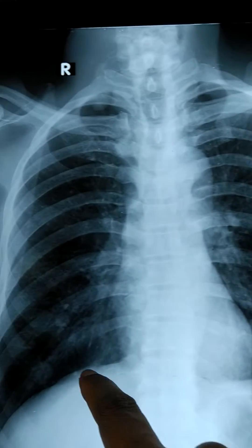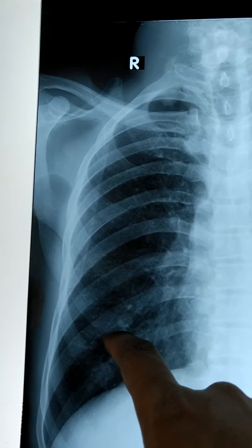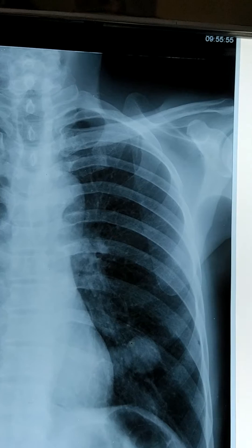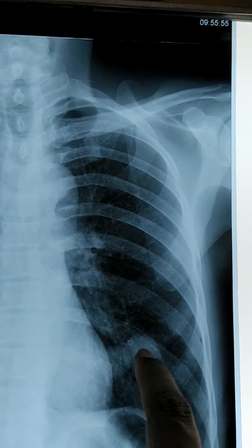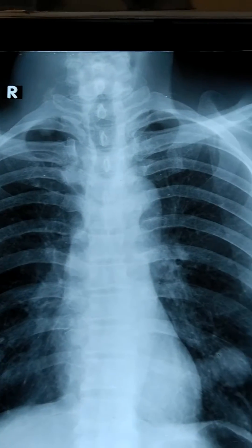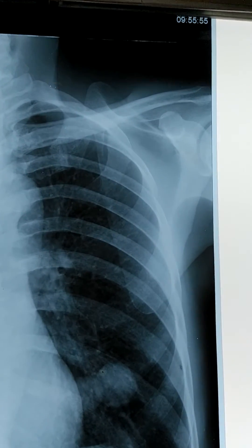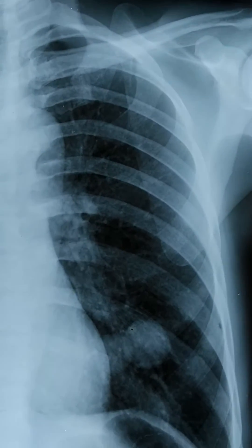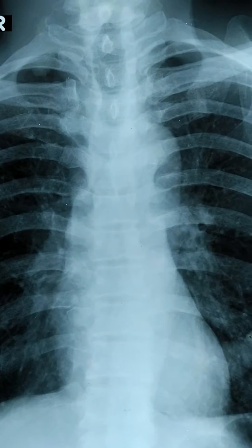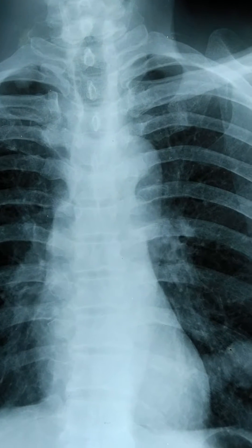This is called a coin shadow. The coin shadow is due to pulmonary nodules. These pulmonary nodules may be primary or secondary metastasis.